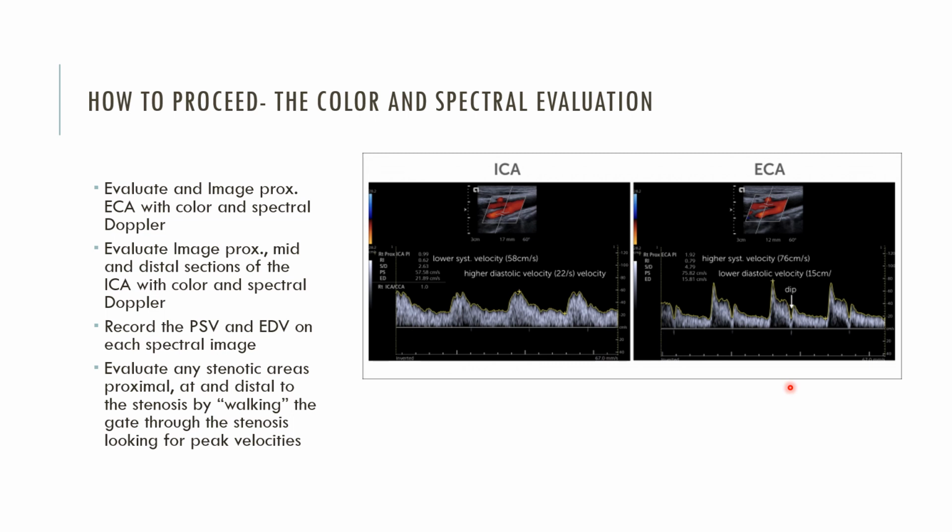The other thing about the ECA is you can do something, as we're going to show you in the next slide, called temporal taps, where you tap right in front of the ear, and you will actually see that tap demonstrated on the waveform of the ECA, but you won't of the ICA. So that would indicate that, yes, you are in the ECA.